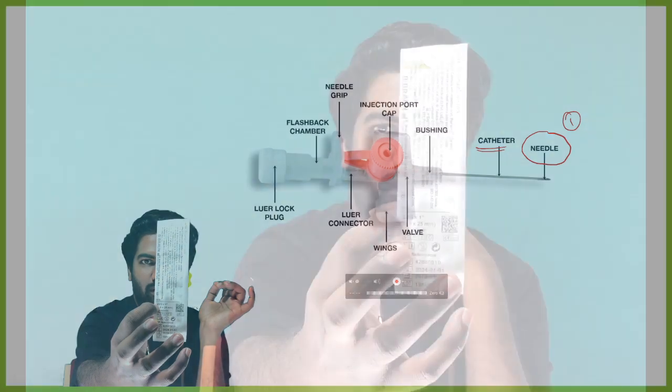Can you see this, guys? 22 gauge. This is one piece of information which you got just because of the paper which has been put here. Another piece of information I'll tell you why it is important. Please cultivate this habit again and again. Just beneath that 22 gauge, they have written 36 ml per minute. That's the amount of flow which it can give through this small diameter cannula.